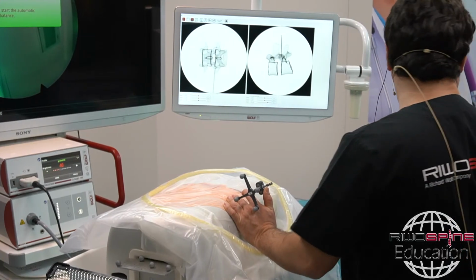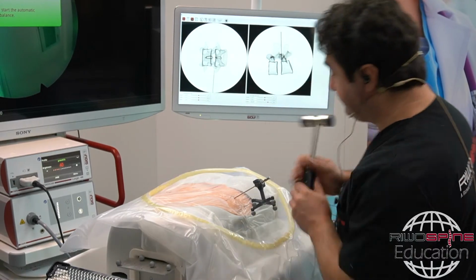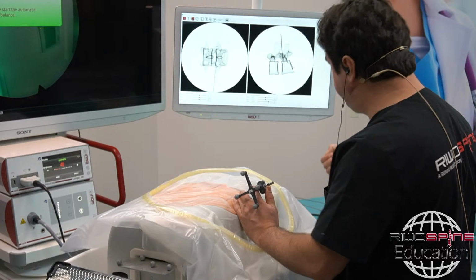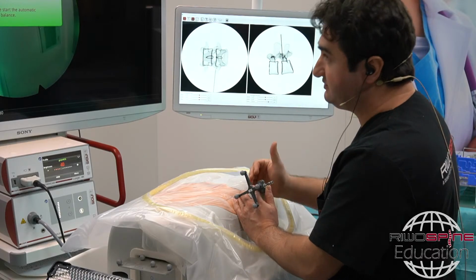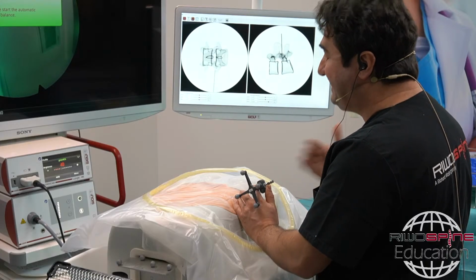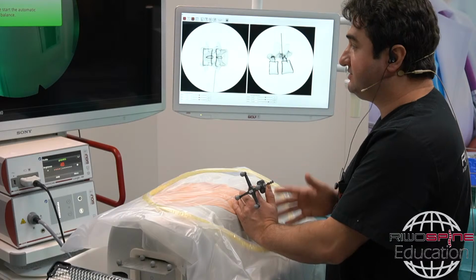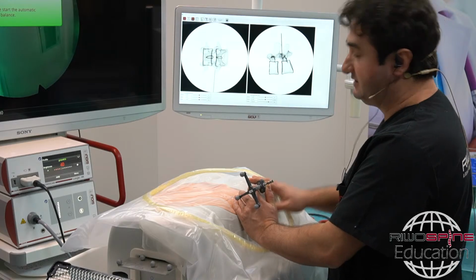The option here is to fix it to the bone with the hammer a little bit. You can place the needle on the bone with the hammer. Then in this way you can keep the guide wire inside the bone, and you can introduce the dilator and the sleeve and start the operation directly like here. But in this case, you are right, everything will be loose. You will get stuck in the foramen with the sleeve, and then you have to control everything. That's why we never recommend that surgeons start directly with this kind of operation, pure extraforaminal operations.